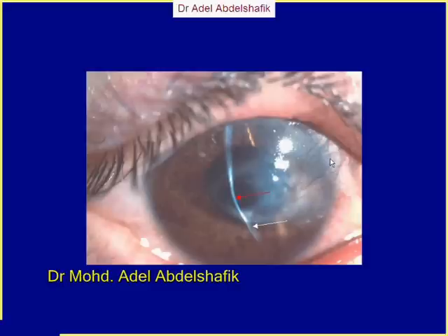Actually, superficial vessels are not straight. The deep ones, the interstitial ones, are the ones that are straight, simply because the ones in the middle of the stroma are compact with the stroma. So they just find their way and move forward. But on the surface, they are not straight. They can be wavy and they can branch. As you notice here, we have branching.